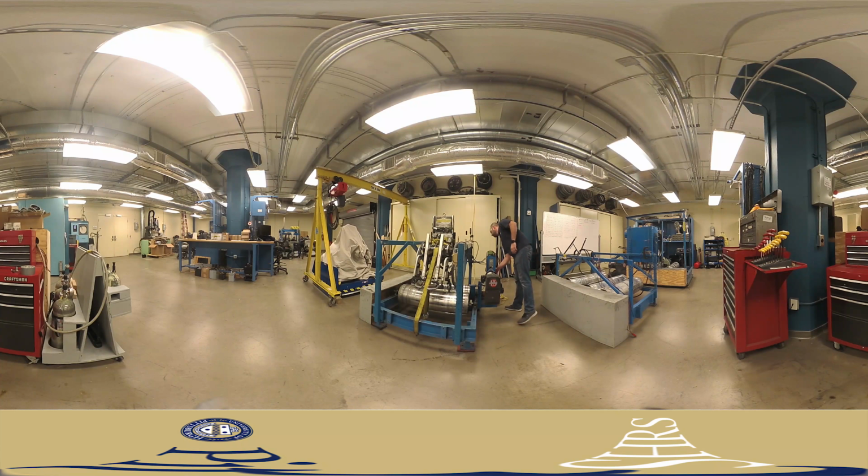You're watching the double drum wheelchair testing machine in HERL's testing laboratory. HERL performs standards testing for manual and powered wheelchairs, as well as lower limb prosthetics. These testing facilities, which include hydraulic material testing frames, an environmental test chamber, and wheelchair fatigue testing machines, allow HERL's researchers to determine the safety and efficacy of their designs for mobility aids, as well as test the quality of mobility products already on the market.